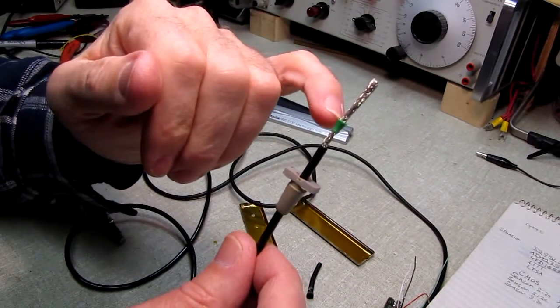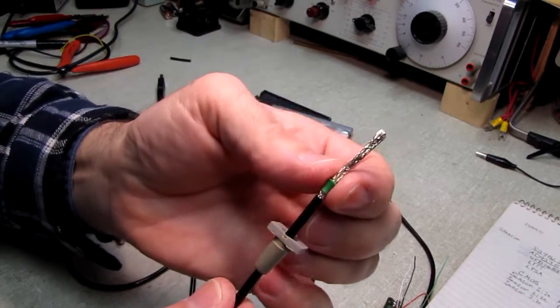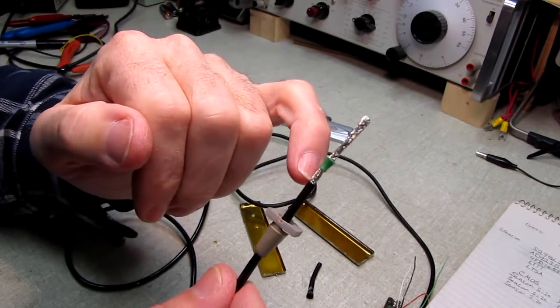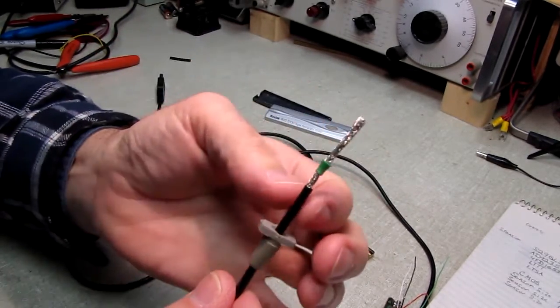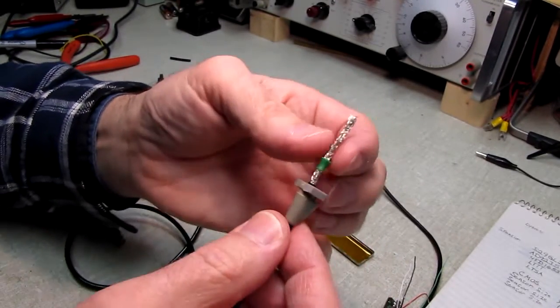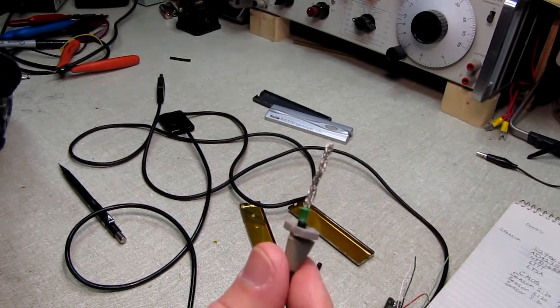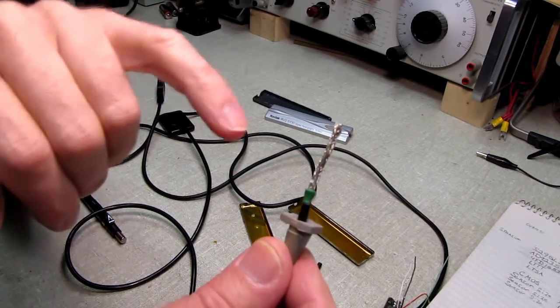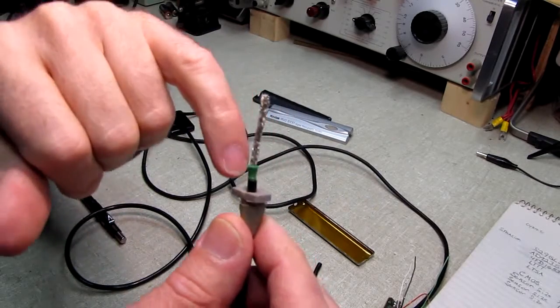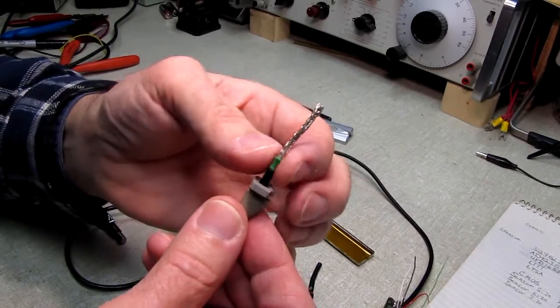There's a little plastic shove-in, conically shaped ferrule, if you will, that has to be driven underneath the jacket of the cable, and that will bind it into this strain relief. Very nice. I had a chore getting that out. It appears they used some sort of cyanoacrylic super glue once this was together to glue it in there, so I had to drive a probe underneath here and break everything loose.